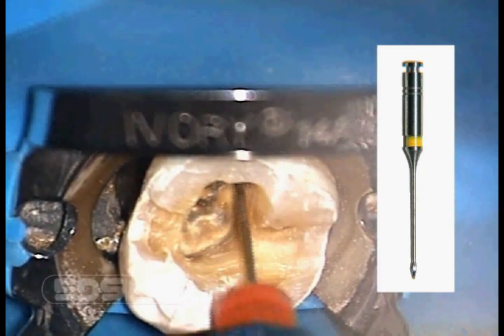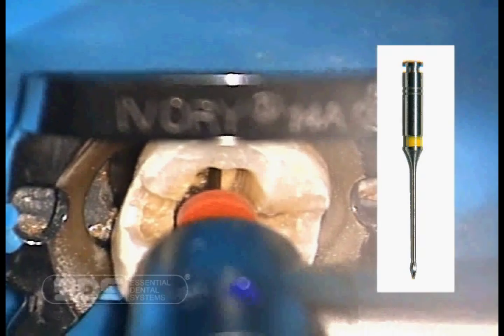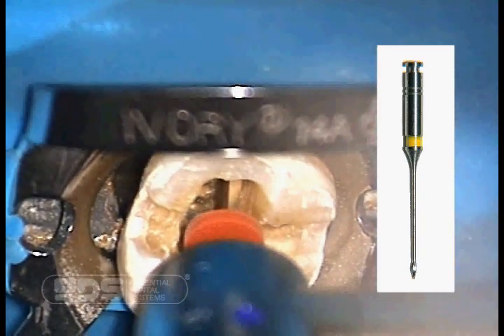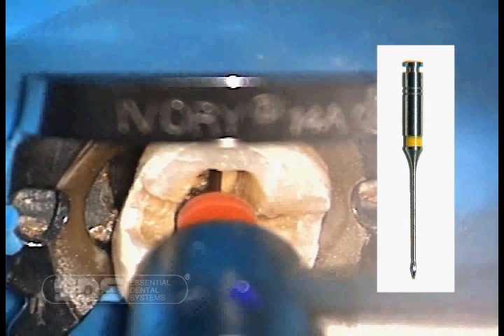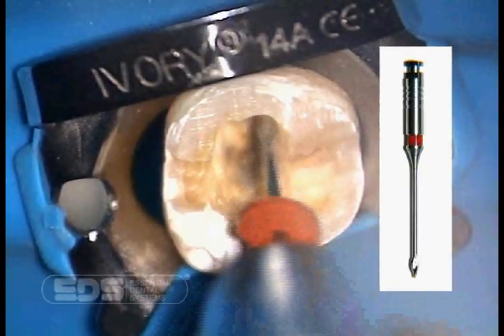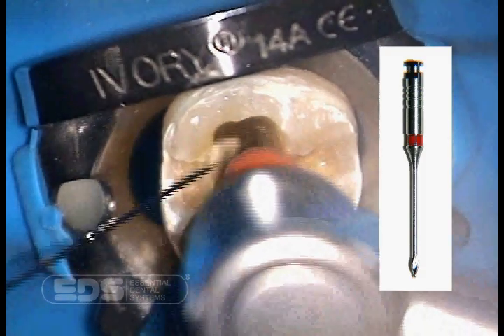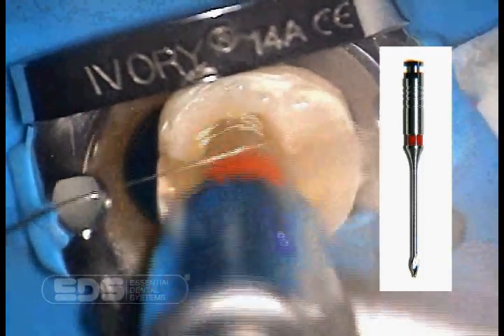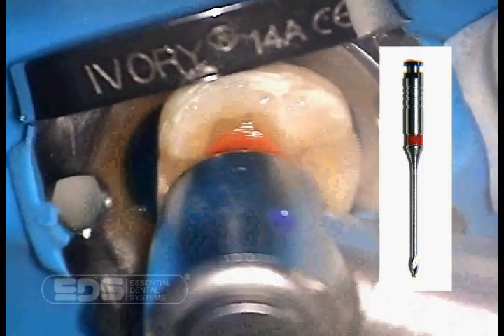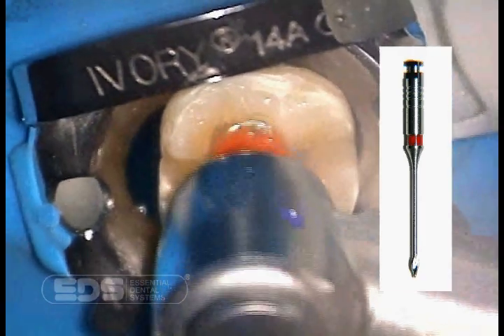Now we will remove the gutta-percha and size the inside of the post hole using Gates Glidden drills. We are using the yellow EDS Gates Glidden drill, then the red EDS Gates Glidden drill with water to remove and size the post hole. We stop at the red size because we chose the red number 1 Flexi Post for the restoration. We make 100% of the post hole length and 90% of the width using these Gates Glidden drills.